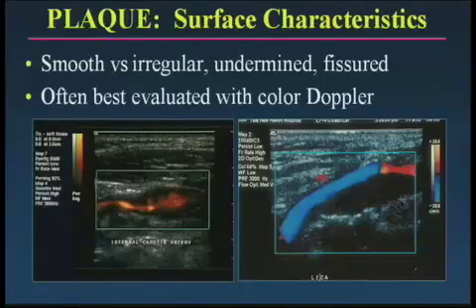And on this patient, however, you can see that the power Doppler demonstrates a very irregular surface to that plaque, probably with some ulcers. And again, you can estimate easily the stenosis of at least about 70 to 80%.